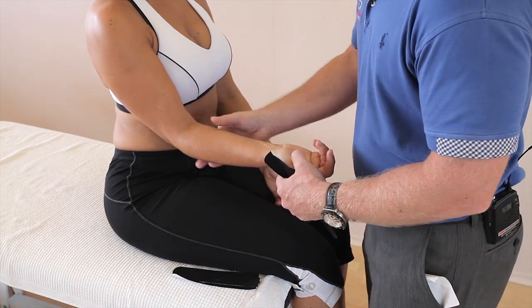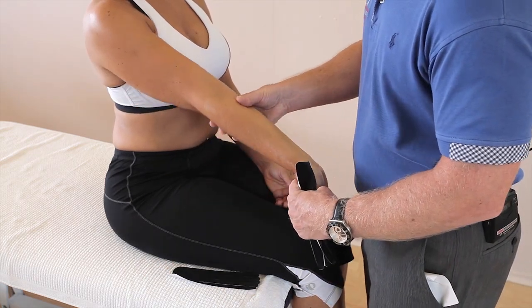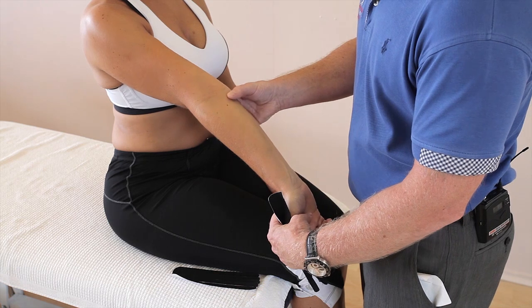What we can do first of all is apply the elbow into a little bit of extension and the wrist into an extension — not too much — and that's the position we start.